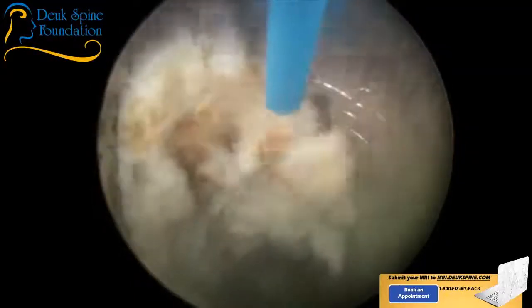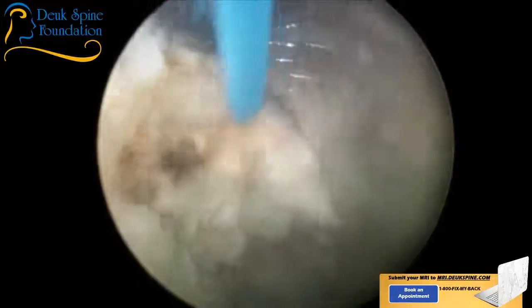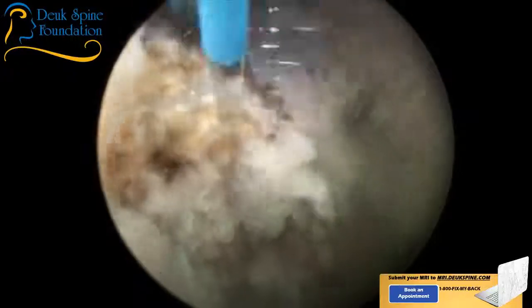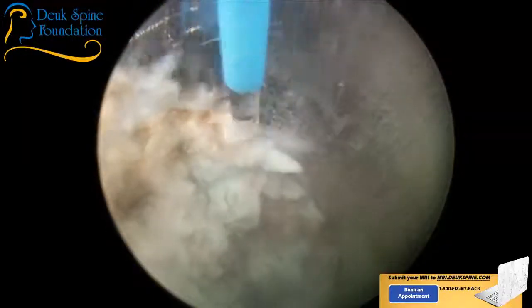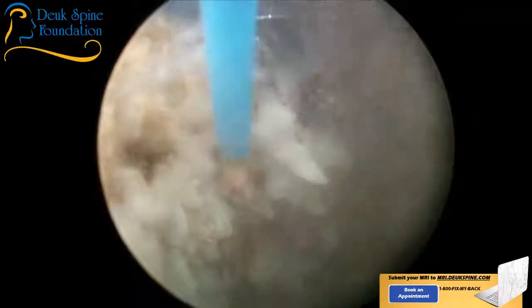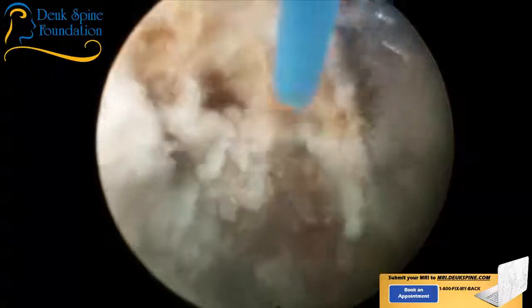Wow. Well, these two discs have basically been left untreated, probably for the reasons I told you. When a doctor looks at them, they can see them and say, you know what, they're definitely abnormal, but they're not bad enough for us to treat. They should have been treated.